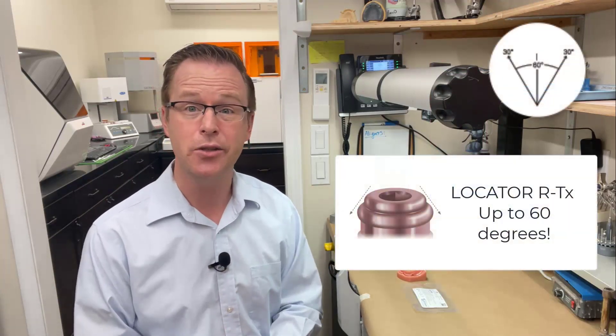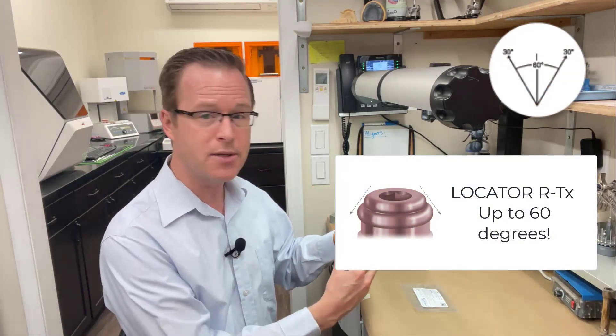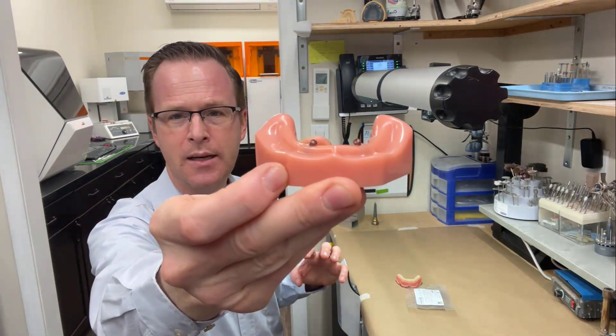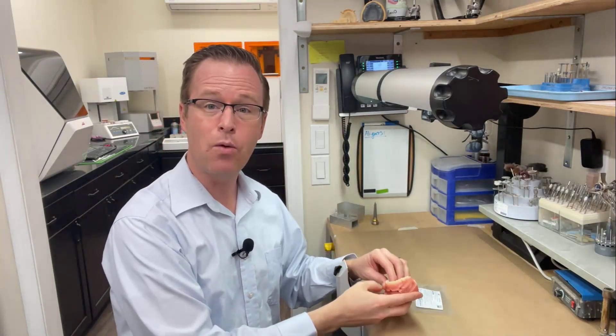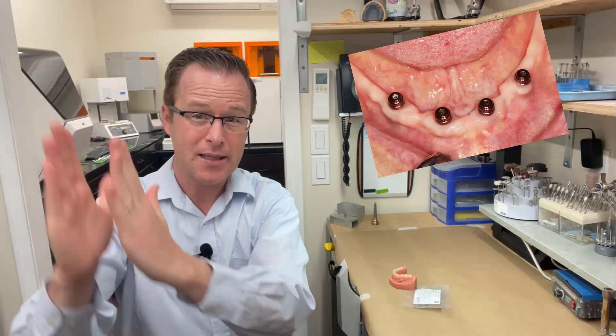As a result, what Zestental Solutions has found over the years is that 60 degrees of divergence allows the clinician to restore an implant overdenture in a challenging situation, such as a patient that comes in with extremely off-angled implants. Now, the only challenge with that is that sometimes we don't place those implants in extremely challenging situations. Many times, as a clinician, I try to make my implants as straight up and down and parallel as possible for an implant overdenture.